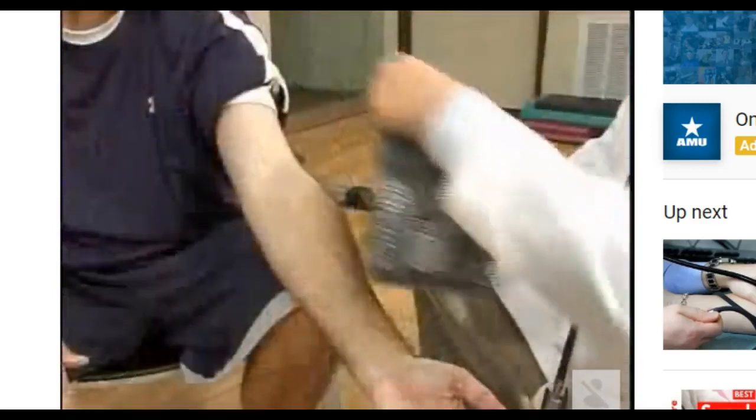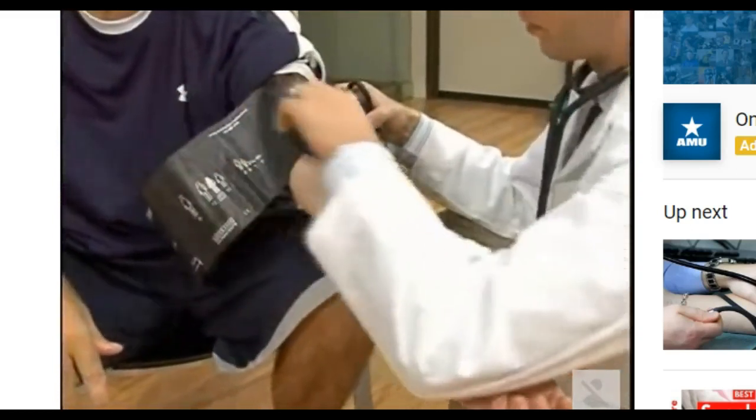For the blood pressure, one, you should be seated and relaxed for about 15 minutes before you actually take it. You should not have consumed alcohol or coffee for 2 hours before taking your blood pressure. You shouldn't have smoked 15 minutes before taking your blood pressure. All those things affect the arterial resistance and therefore will cause an artificial elevation, or for the most part will be elevated beyond what it should be.